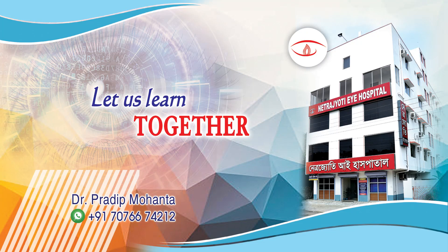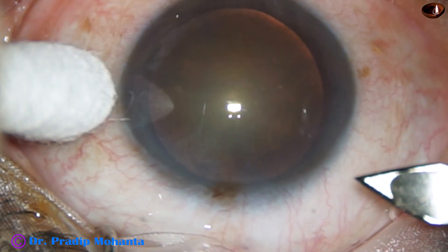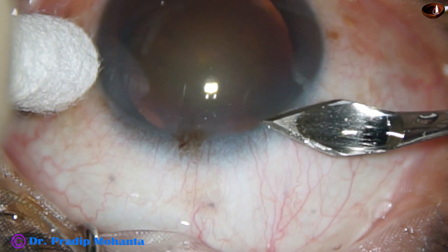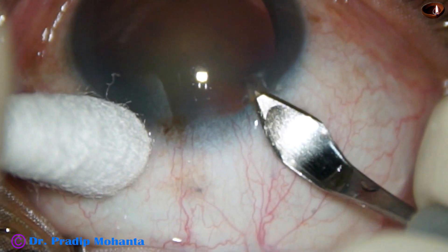Friends, welcome to my workplace at Rana Ghat, West Bengal, India. This is a routine phacoemulsification, but sometimes in a routine case, we may have a lot of struggles.